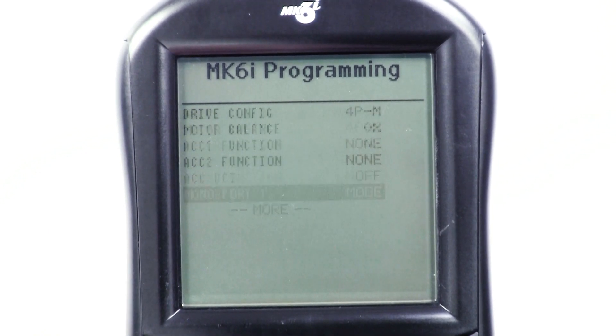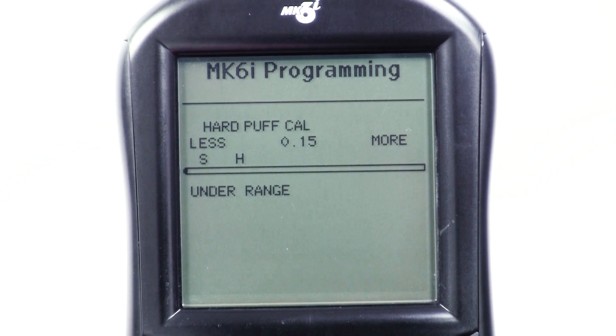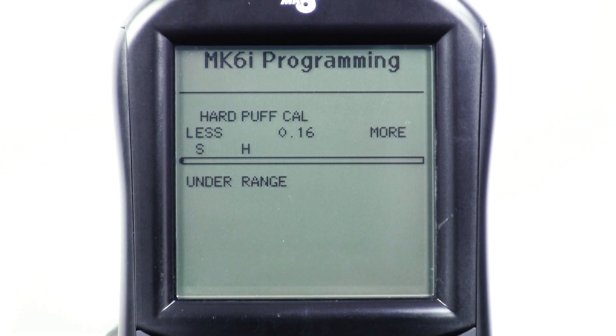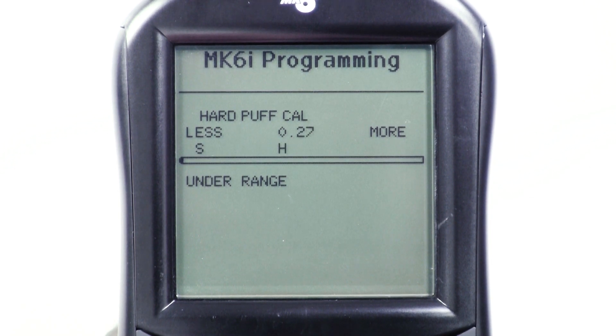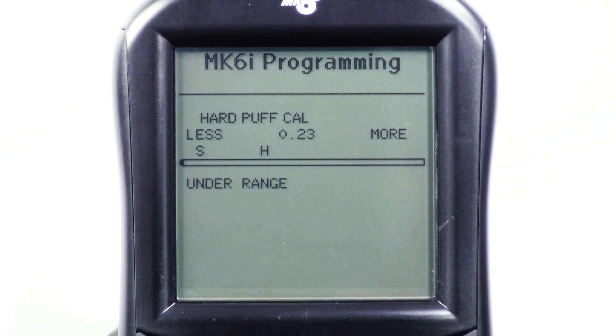Scroll down to hard puff calibrate and press select again. In hard calibration mode, the up and down arrows of the programmer move the H value on the scale of the display. It's this H value that the user has to hit when they puff hard. Ask the user to puff hard into the sip and puff straw and see how far the bars on the display light up to the right.